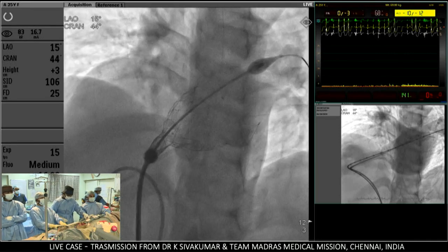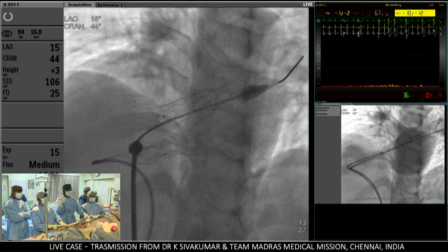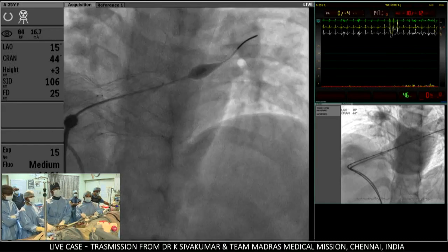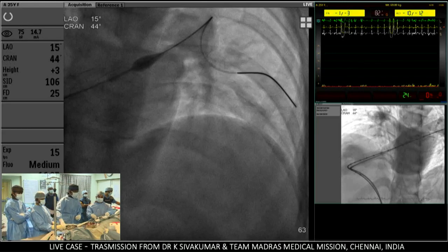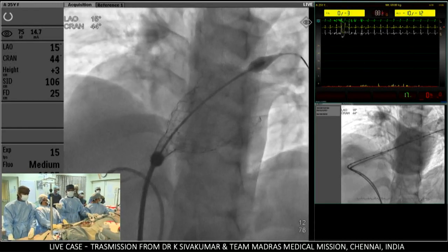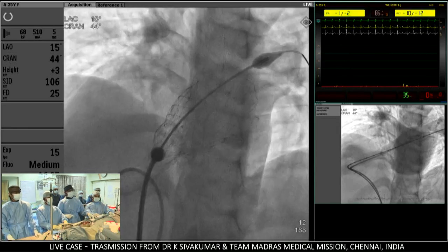Fluoro store that and playback. Fluoro store. Okay. Can you show the wire position is coming off? So can you hold it? I'll just advance the wire a little bit inside. Yeah, that's enough. Now show the previous fluoro store. Yeah, this is the release sequence. Get ready for 25 to 18. The moment this release is completed, this is actually a stored fluoro, Varakan. This is not live.